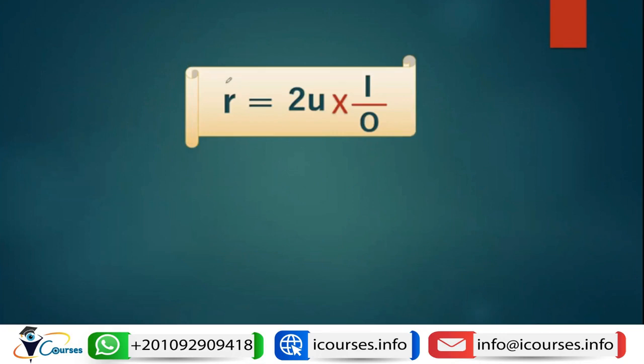Okay. So the radius of curvature can be calculated by the same equation. It will be double the object distance, which is known. And this is all calculated by the device, not by you. We only have two variables, the image size and the object size. So if we fix the object size and we adjust the image size by the doubling device, once we reach the correct image size, we can check the reading in the keratometer, so that this reading will reflect the power of the cornea and the radius of curvature.